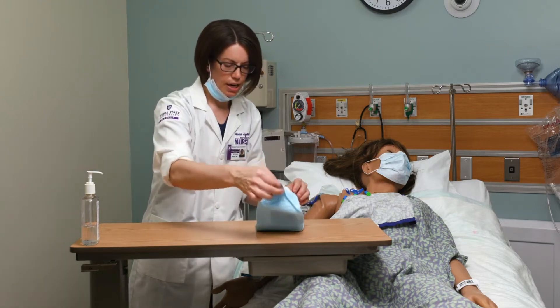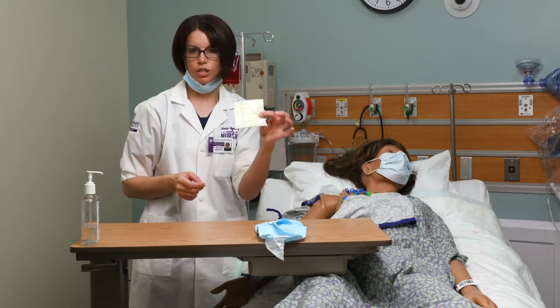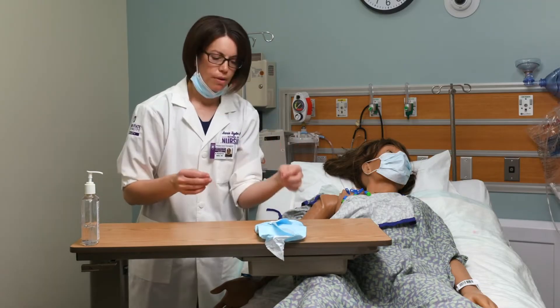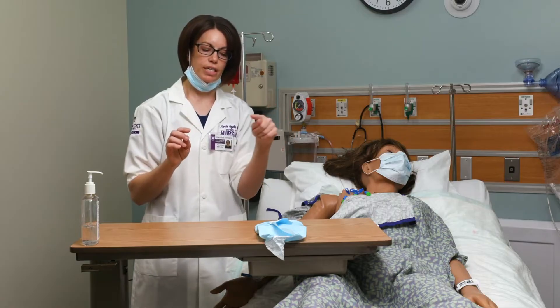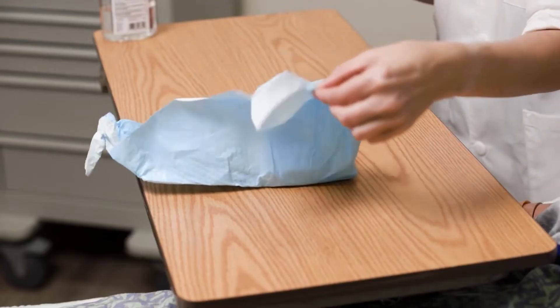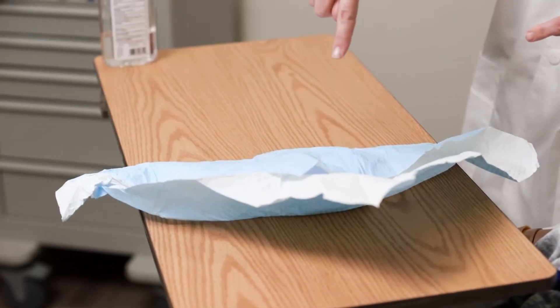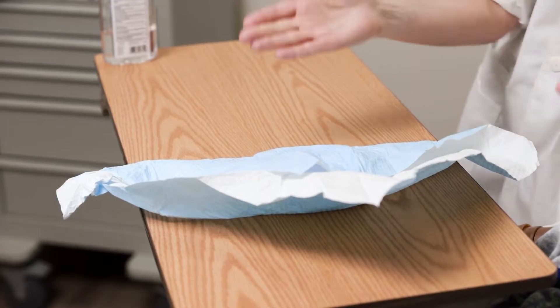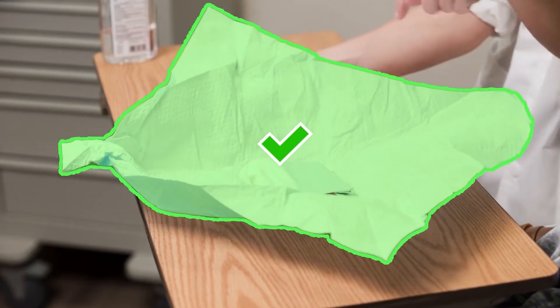Inside the kit there's another mask, so if we wanted to use that on the patient we could. I'm now opening up my sterile kit and I need to make sure I'm only touching the one-inch border around the outside. As I open my side, I have to make sure that if it folds back in, I'm not touching anywhere on the inside of the sterile field.